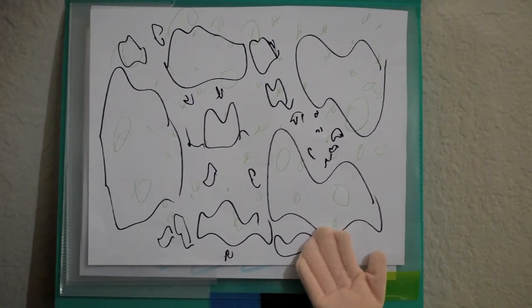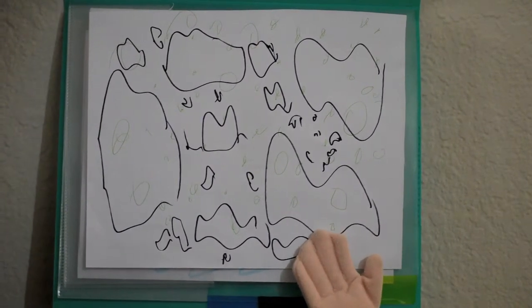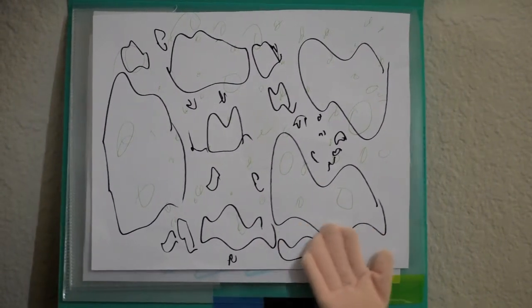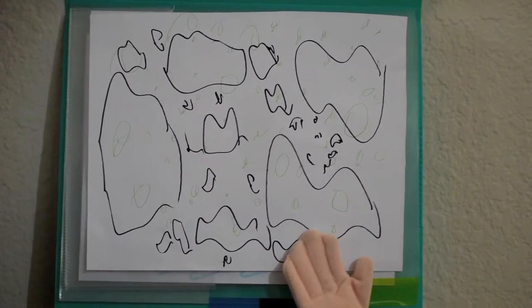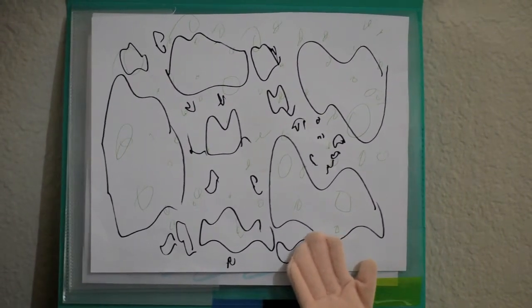Now, single emulsion gives better detail, yet double emulsion allows for a lower patient dose, and you always want to do as little as possible in terms of exposing your patient to radiation. The double emulsion means that there are more receptors, which allow you to lessen the dose and still capture the image. Double emulsion also means that you will have parallax, because the two images are superimposed on each other. The resulting blurred edges are why single emulsion gives better detail.